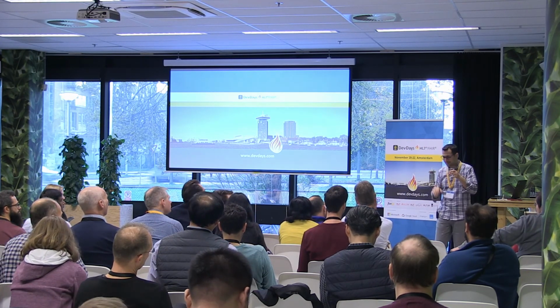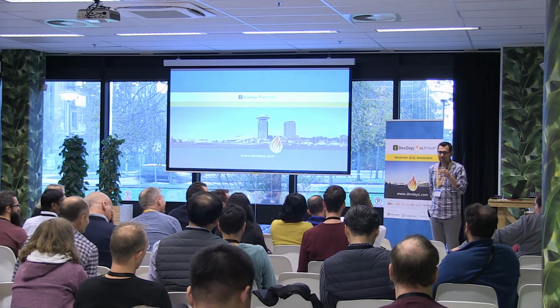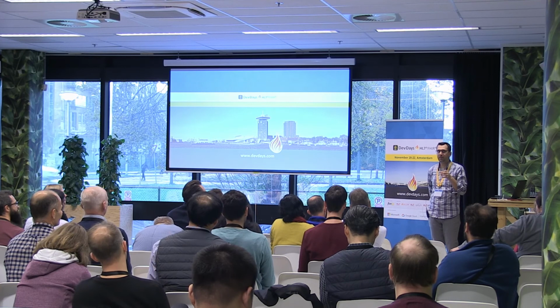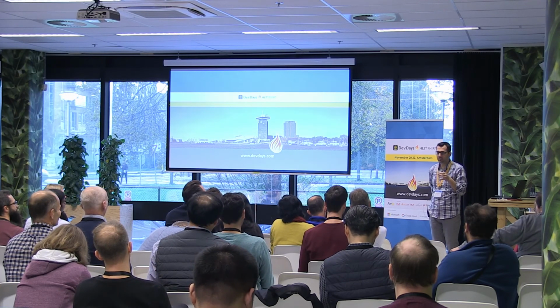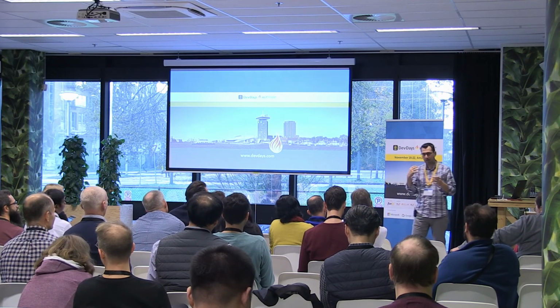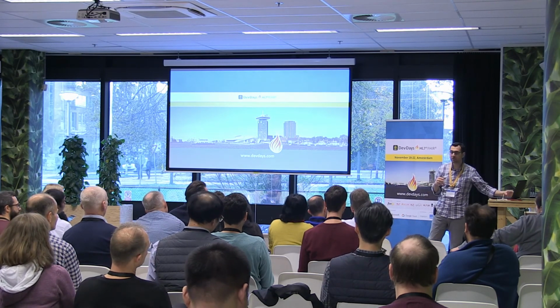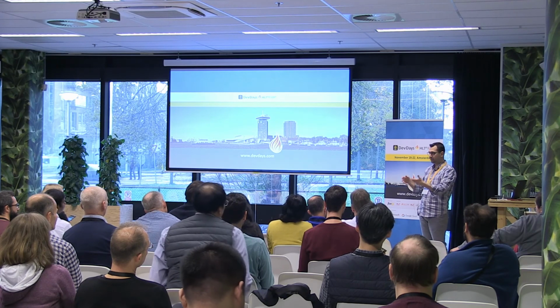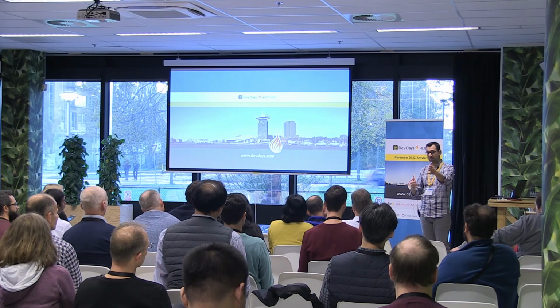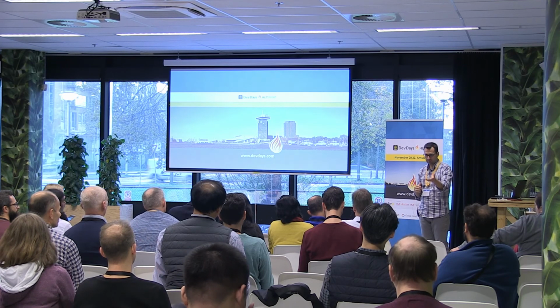It sucks. No, I'm joking. Isn't that closer to FHIR? It is, but DICOM structured reporting, I feel like it may be even older than FHIR, to be honest with you. Now, it is not really conceived, in my opinion, to author diagnostic reports as much as it's used for computer-generated measurements and things like that. So these days you go in for an ultrasound, the machine might generate a bunch of measurements, and DICOM SR is a very nice format for keeping these measurements in a structured way. Does that answer your question?